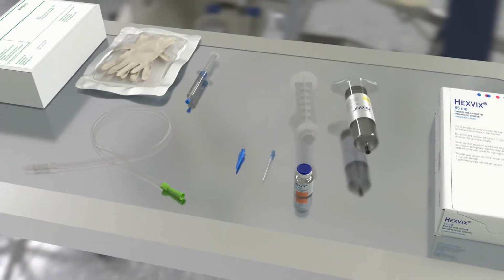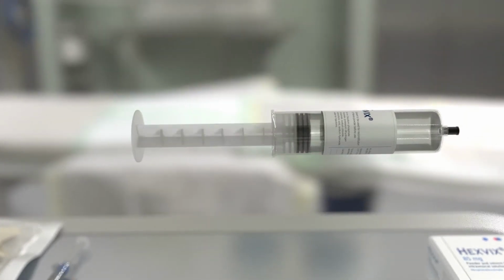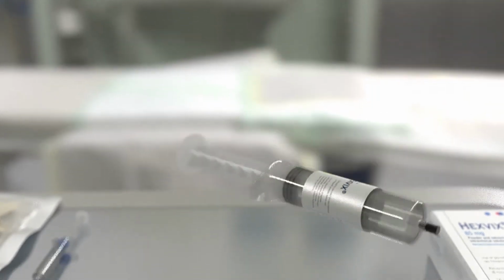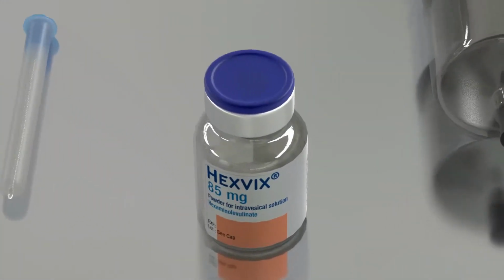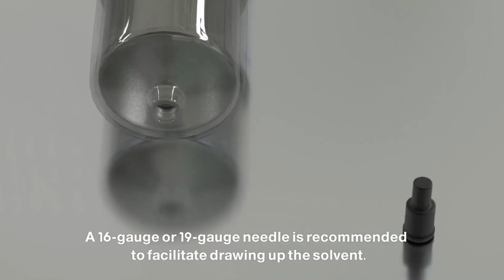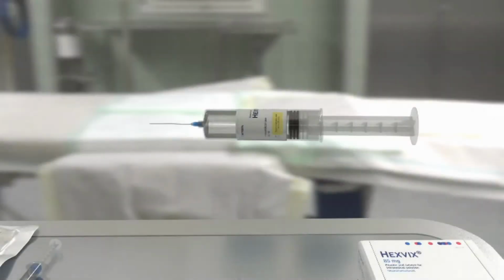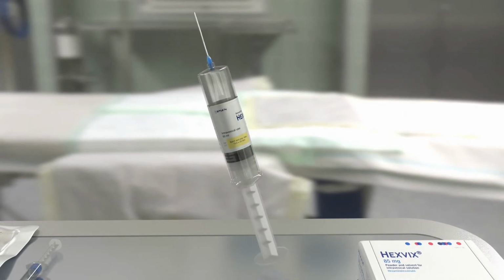Fasten the plunger rod into the rubber stopper of the syringe by turning the plunger rod clockwise until it stops. Remove the blue cap from the powder vial. Remove the cap from the syringe and keep it for later use. Connect a needle suitable for reconstitution to the syringe. Hold the syringe upright and carefully press the plunger rod upward to remove air.